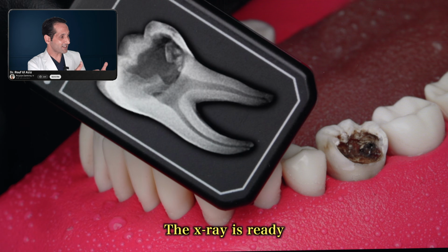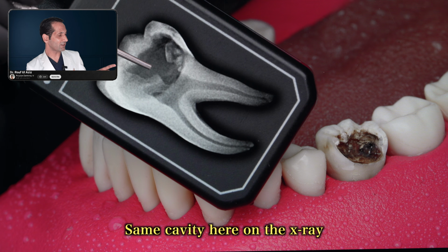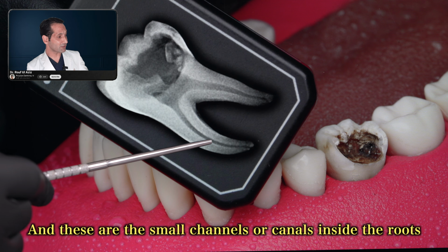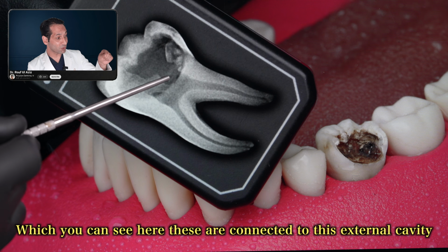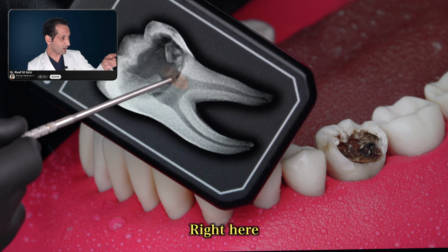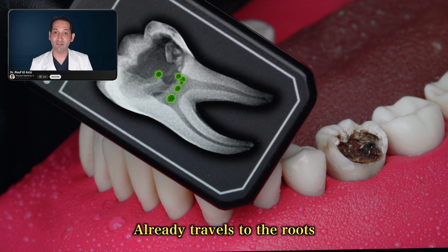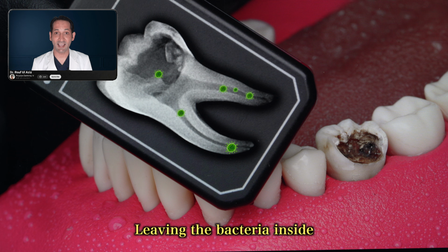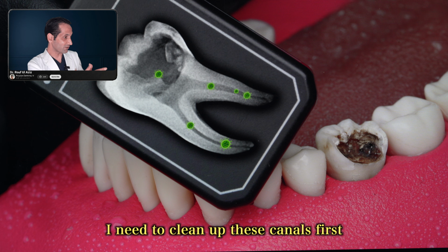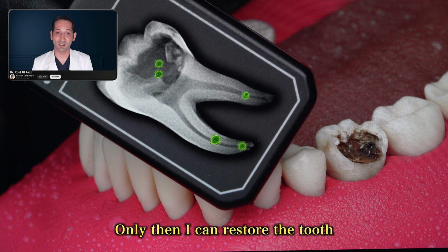Okay, the x-ray is ready. This is the cavity on the tooth, same cavity here on the x-ray. And these are the small channels or canals inside the roots, which you can see here. These are connected to this external cavity. Yeah, right here. It means the bacteria from the cavity already traveled to the roots, and I cannot restore the tooth simply by placing the filling on top, leaving the bacteria inside. I need to clean up these canals first by the process of root canal treatment. Only then I can restore the tooth.